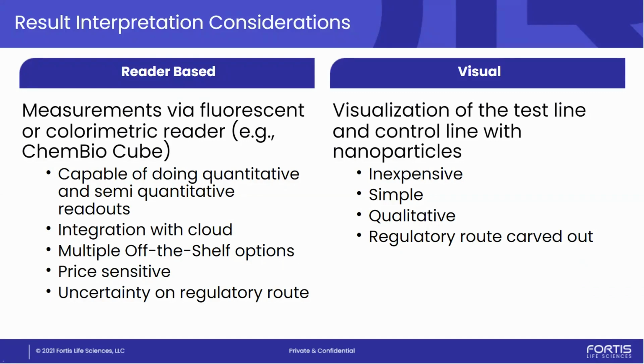Typically, the FDA doesn't like an untrained operator making a determination of what a lot and a little is and what that changes in their behavior. That's why there's no IFU that says if your line is really intense for COVID, you're at higher risk than if it's a lower one. It's like, no, if you have a line, you have a line, and that means you're positive. That is for certain products. And for infectious disease, it's very worthwhile to not overcomplicate it, but there's multiple paths.